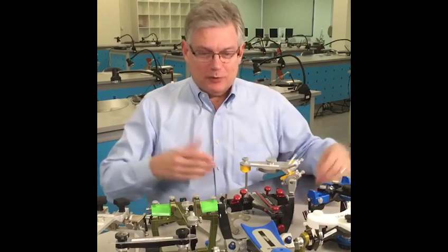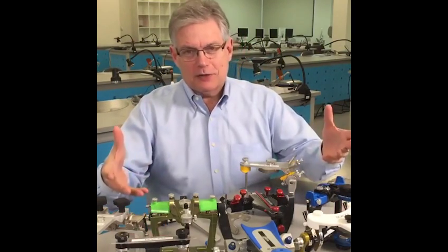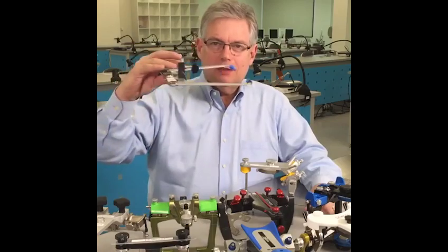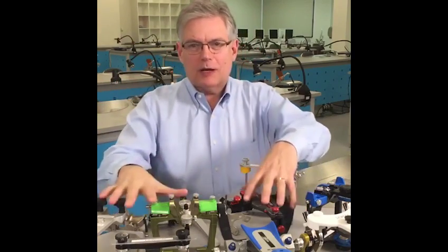I'm Gary DeWood from Spear Education. I'm here with some of my best friends — some of my articulators. I've been collecting articulators for a number of years. I'd like to spend a few minutes and give you a couple of tips about using this with an articulator. This is an ear bow, but first let me talk a bit about articulators.